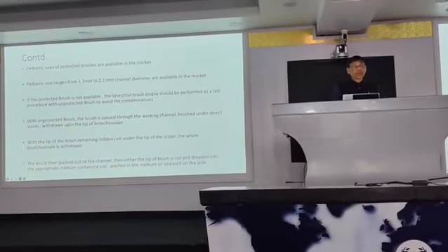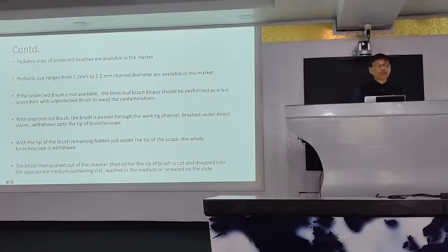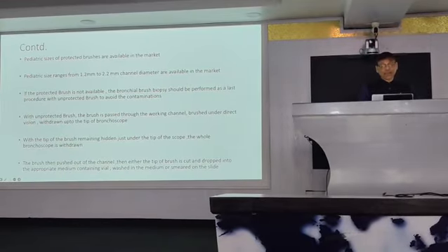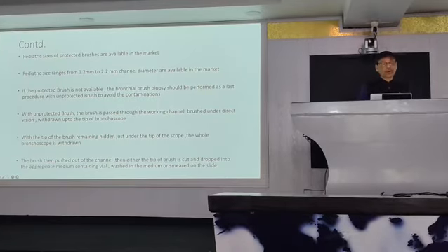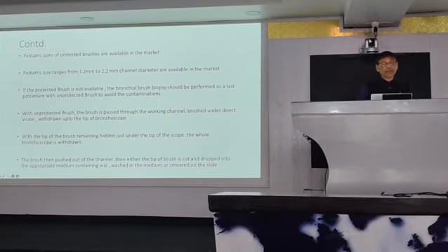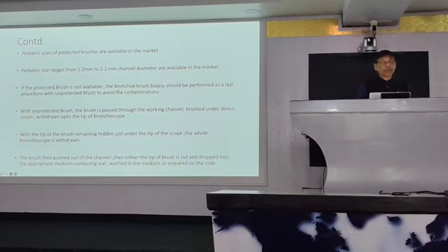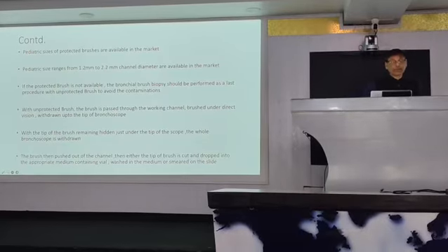Pediatric sizes of protected brushes are available in the market. Pediatric sizes range from 1.2 mm to 2.2 mm channel diameter. If the protected brush is not available, then what can we do? The bronchial brush biopsy should be performed as the last procedure with an unprotected brush to avoid contamination. So there are unprotected brushes also.